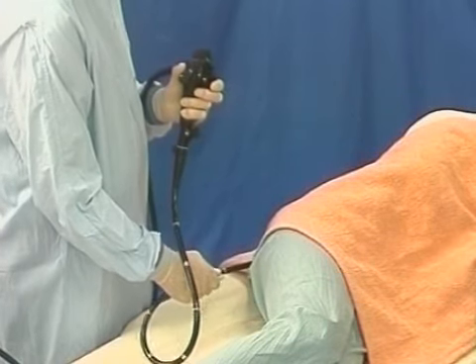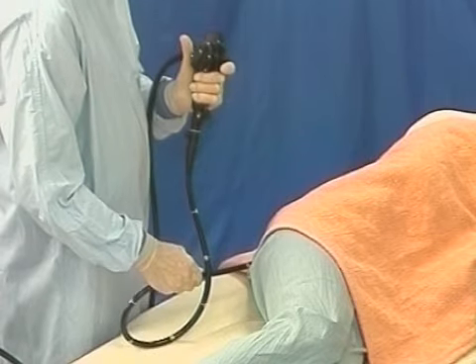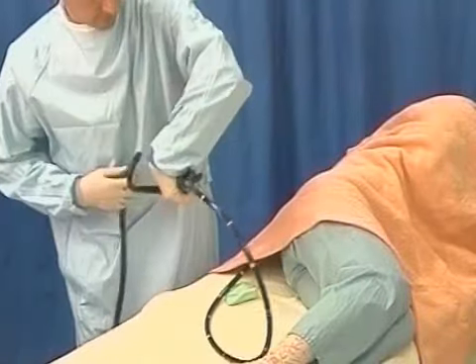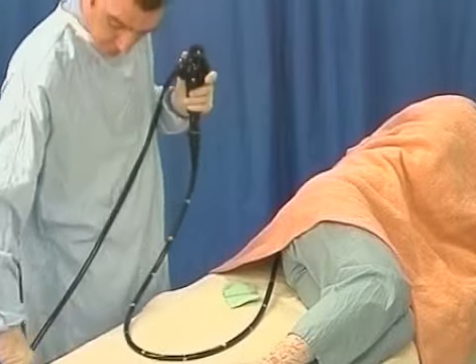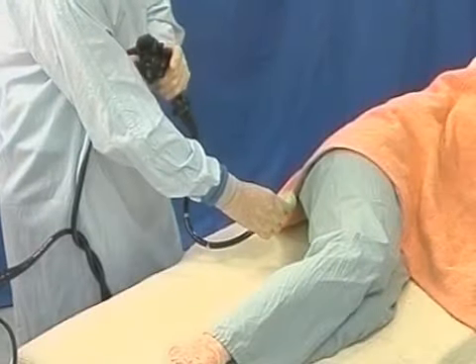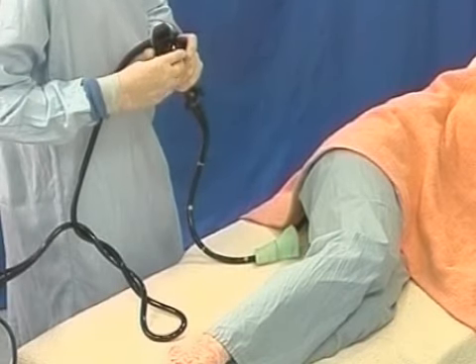Rotating and derotating the shaft often results in loops outside the patient, which makes shaft handling awkward. Straighten out the shaft by derotating the control body, so the loops are transferred from the shaft, where they matter, to the umbilical, where they don't. There may be up to 3 loops in the umbilical before it needs to be disconnected from the light source and straightened.